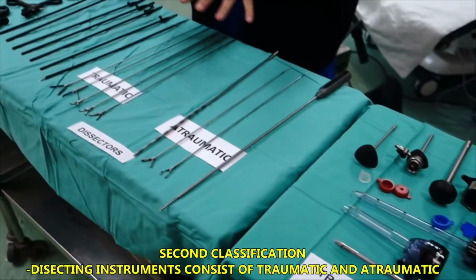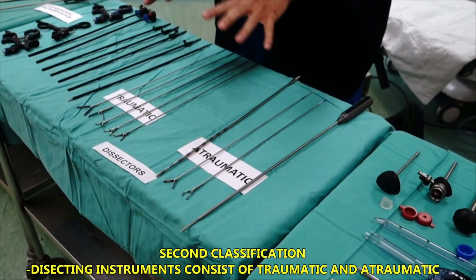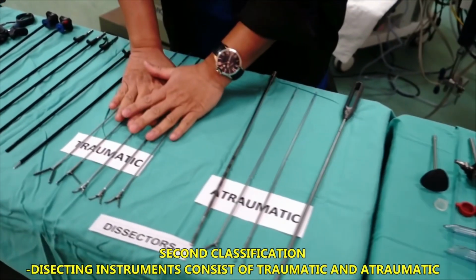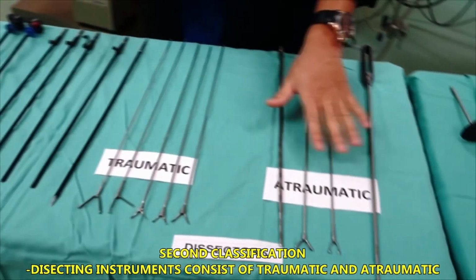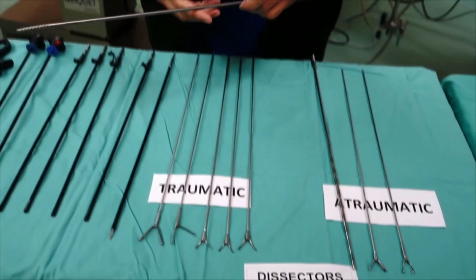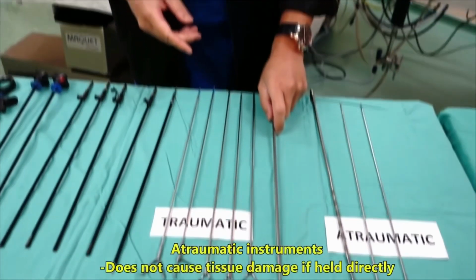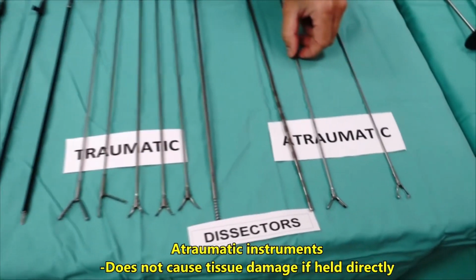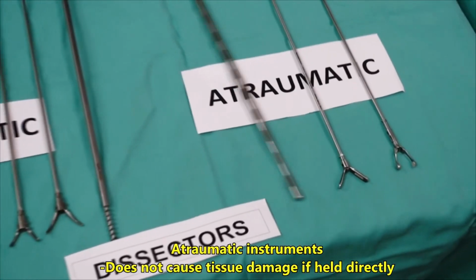The second one is what we call the dissecting instruments. Dissecting instruments are divided into two: one is the atraumatic dissecting instrument, the other is the traumatic dissecting instrument. Now, what is the difference between the atraumatic and traumatic instruments? Atraumatic instruments basically means that it doesn't cause any tissue damage if you hold it directly, okay?